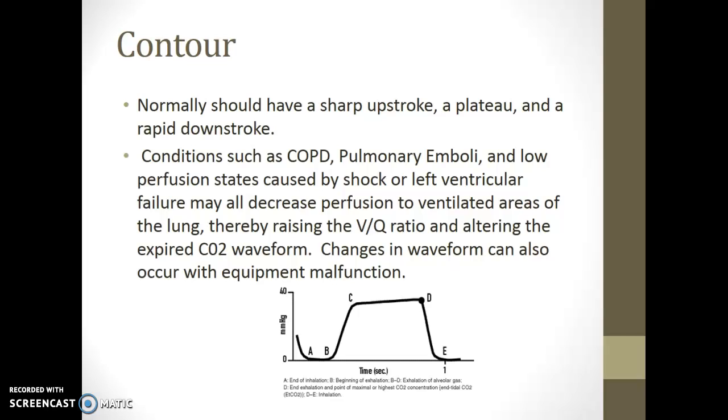So changes in the waveform can also occur with equipment malfunction. So if you don't see the sharp upstroke, plateau, and sharp downstroke, then it's either equipment malfunction or they may have some sort of VQ ratio causing disease or condition.